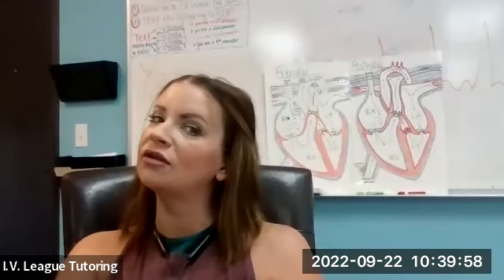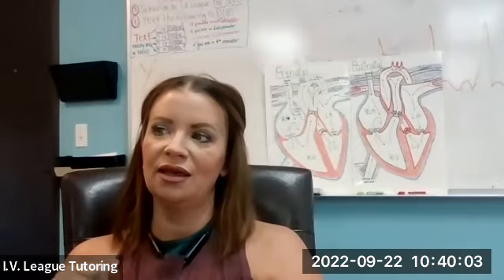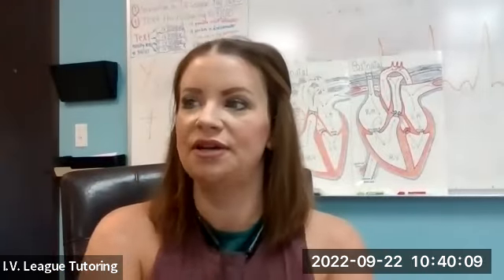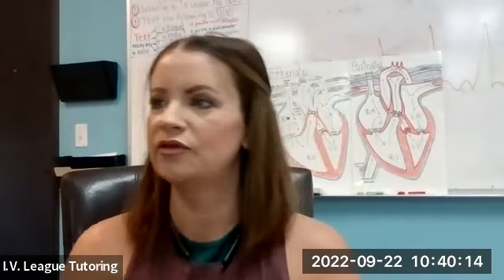Is the QRS less than 0.12? Does every P come with a QRS? And are the P waves normal? Y'all said that. If all those things are true, that is a normal sinus rhythm. Don't look at your paper. Turn them over for a second.